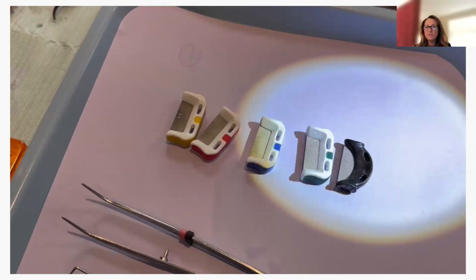So here's the ones that I talked about for the IPR that have the little parts for your finger. I think you have better control than you do with the strips. If you're using the strips, make sure your assistant's holding that lip up, because I've seen many times where that lip has fallen down and wasn't a pretty sight.